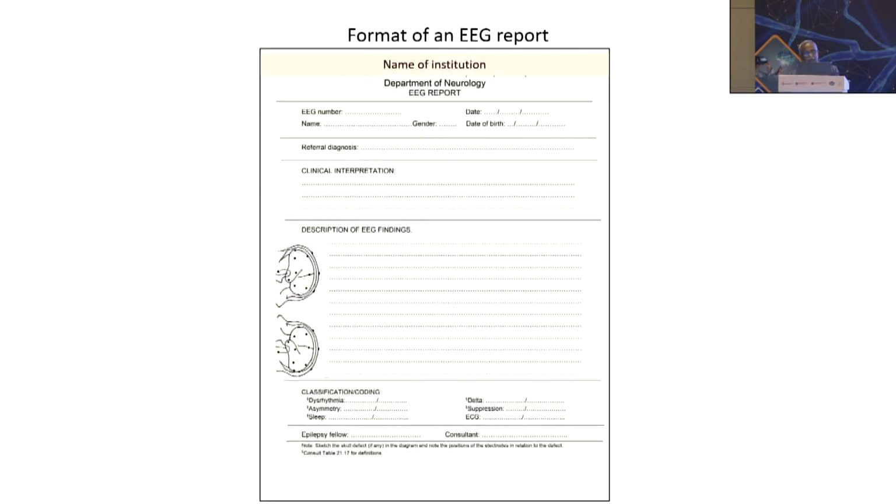If you start describing various EEG forms, they may not understand them properly. What they are interested in is your clinical interpretation, whether it conforms to the clinical suspicion, or needs to be modified, or requires additional studies to make a conclusion.